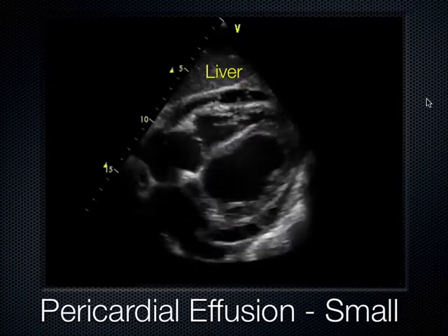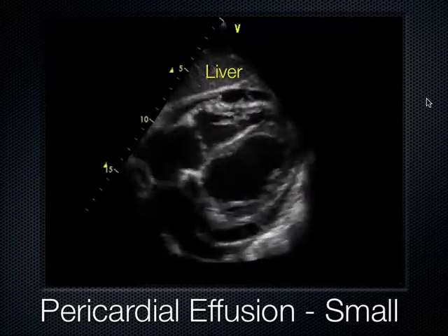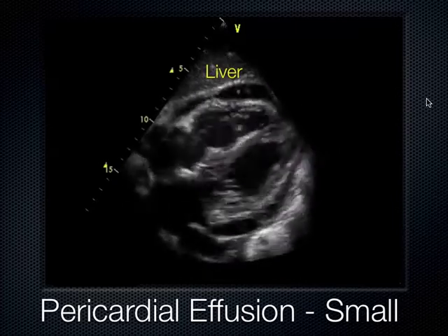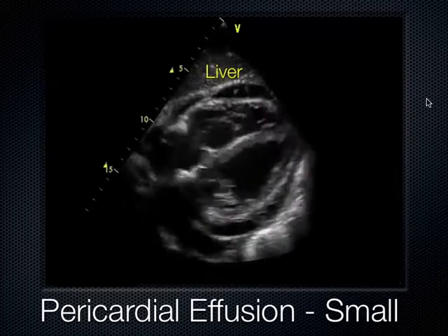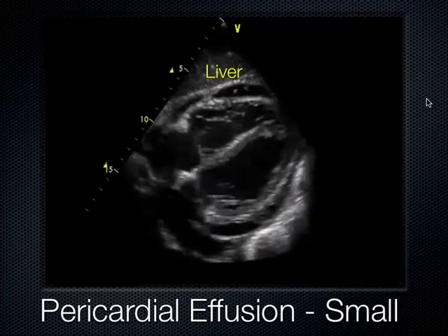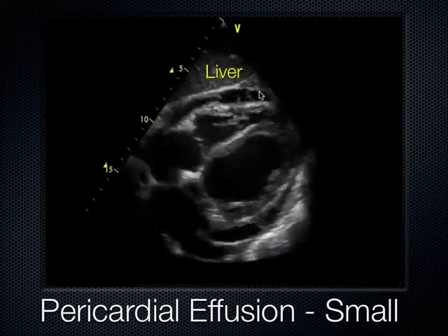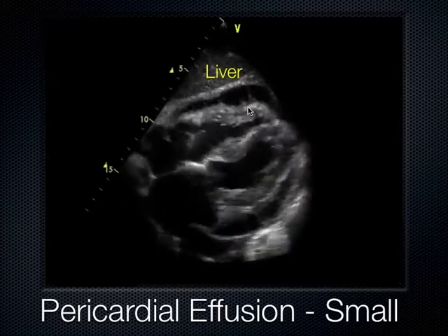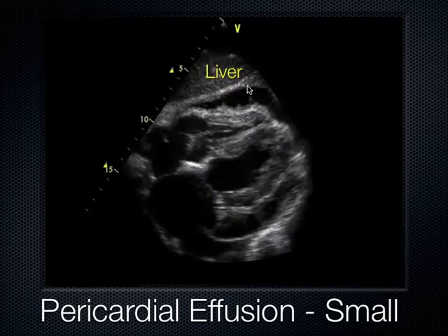And to really decide that, you'd probably need to do some kind of volumetric scan of the heart in 3 dimensions, and then take the area under the curve using calculus or something that I don't know anything about. So the answer is I don't know. But what I do is, during the end of systole, when the ventricle pulls away from the pericardium at its maximal point, I would then drop a caliper and measure.